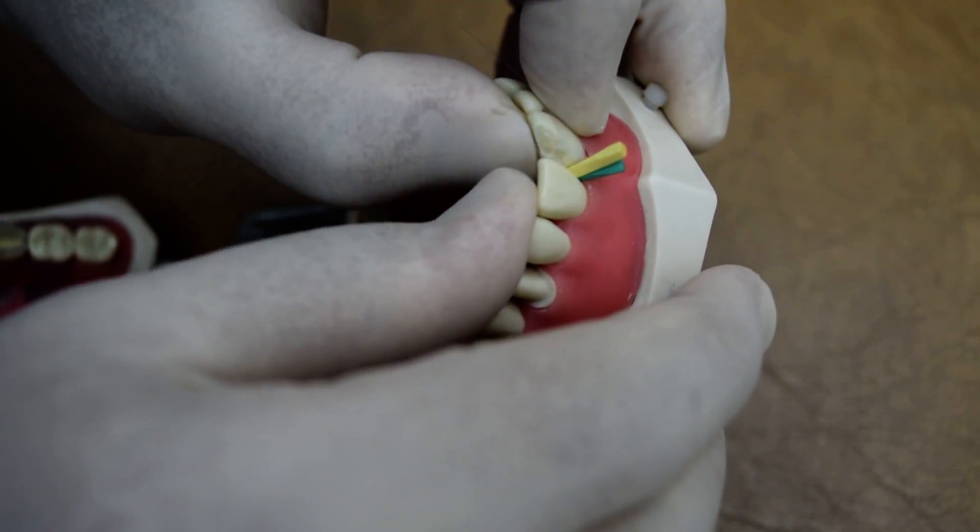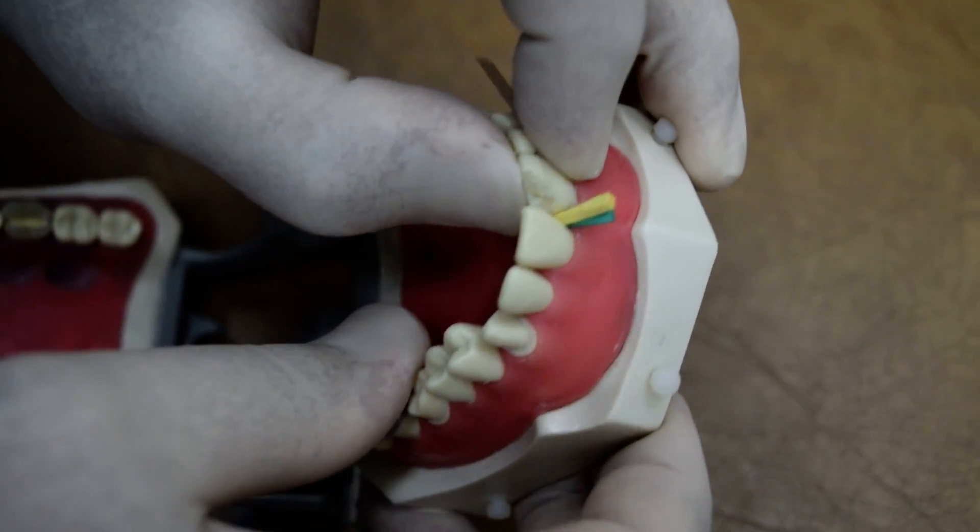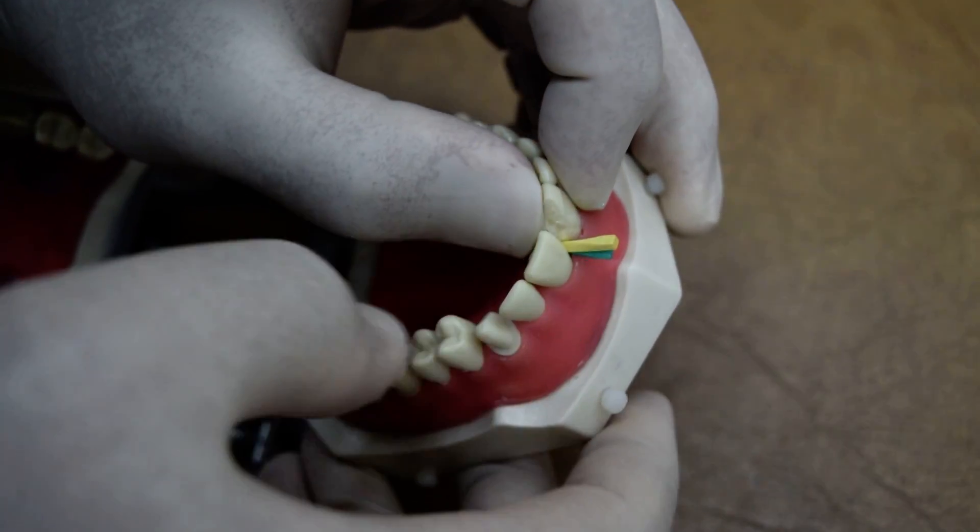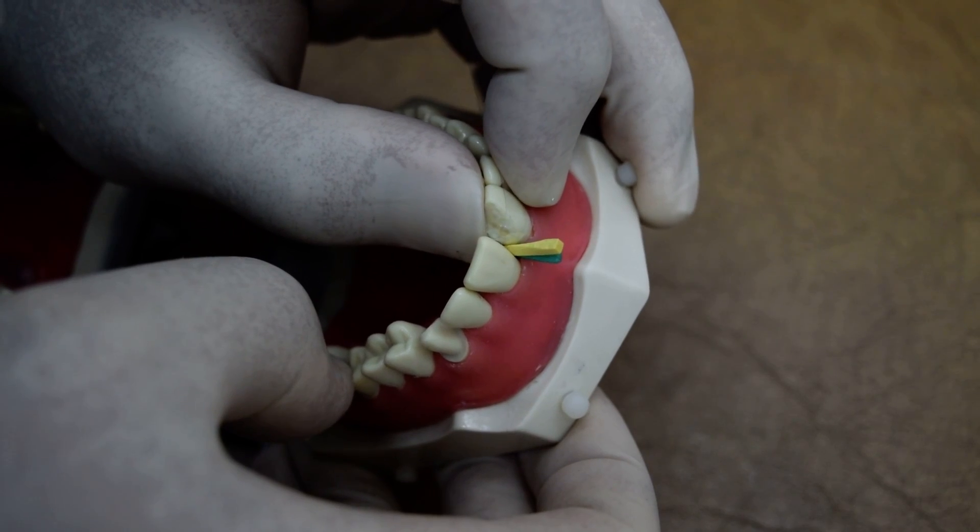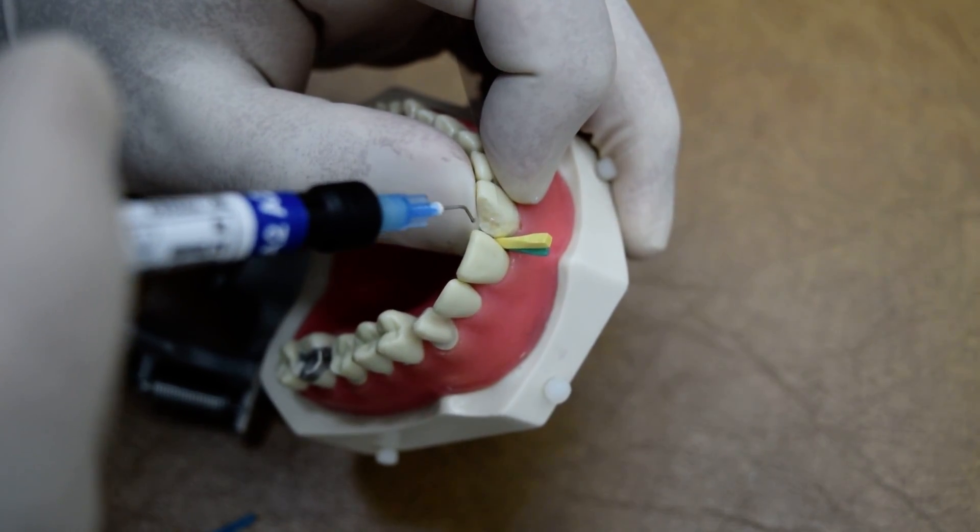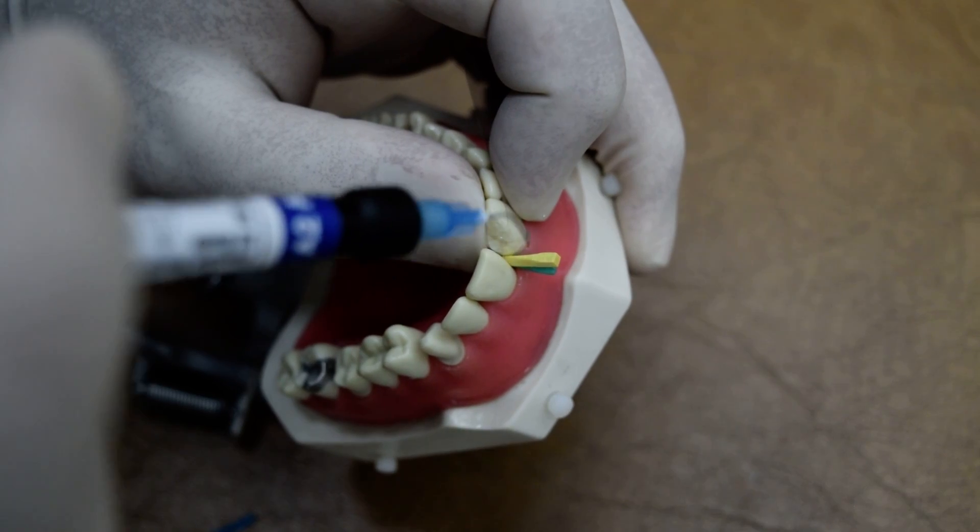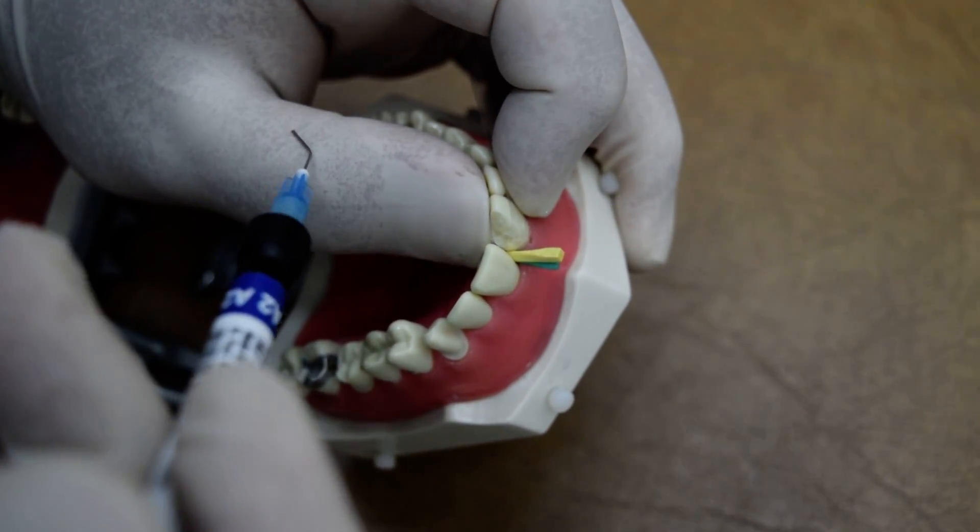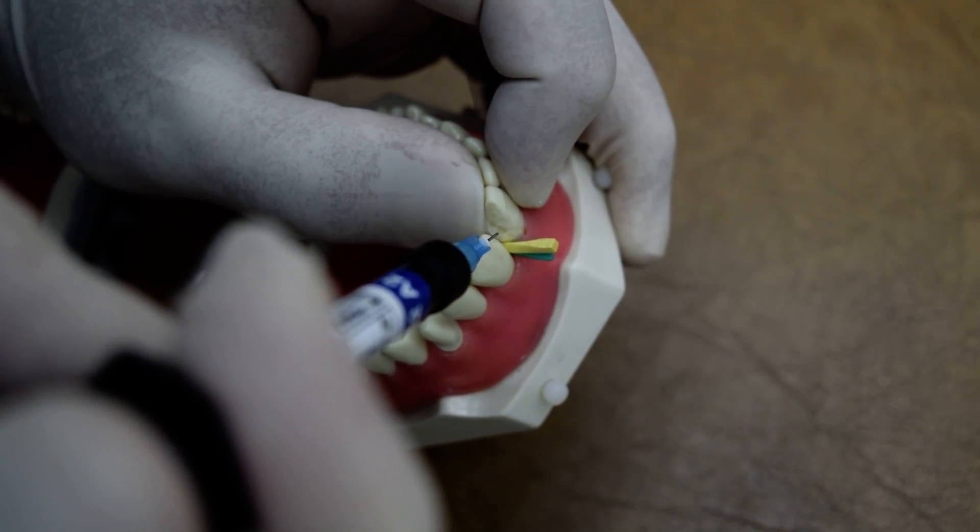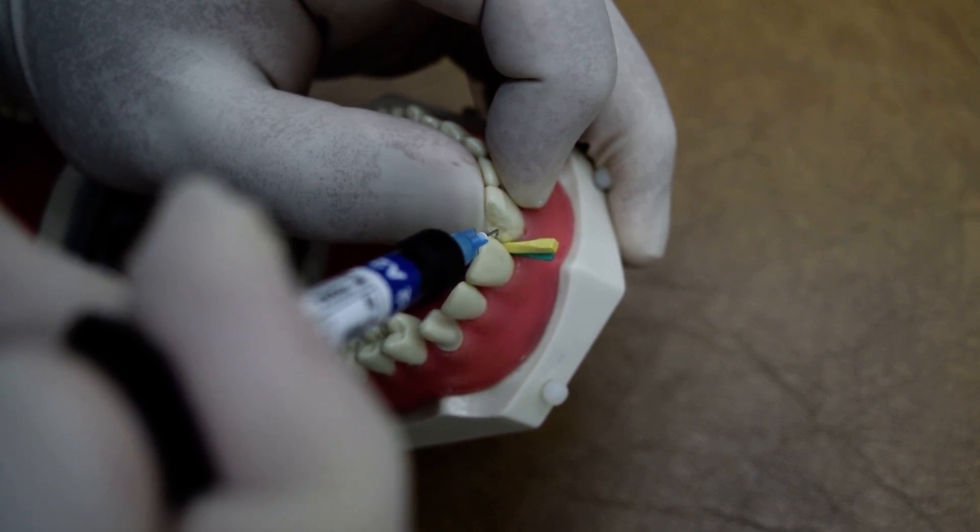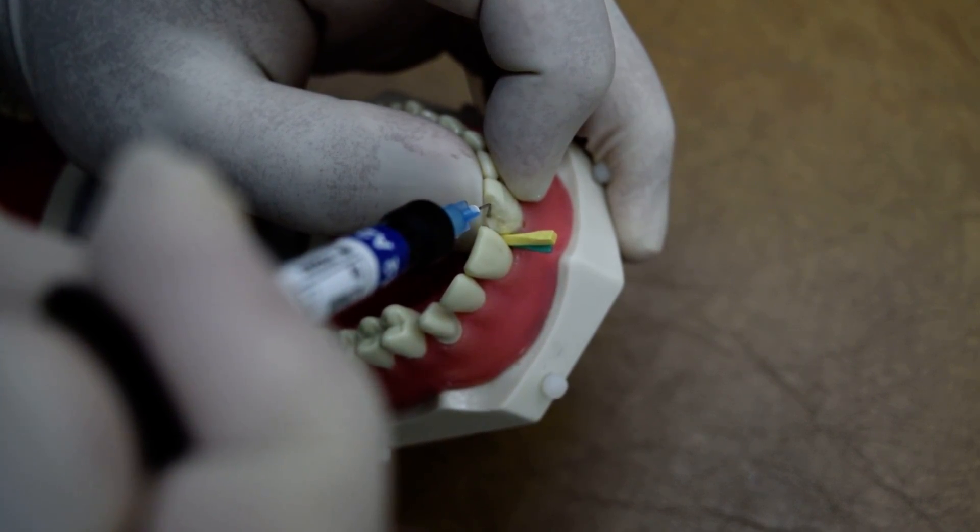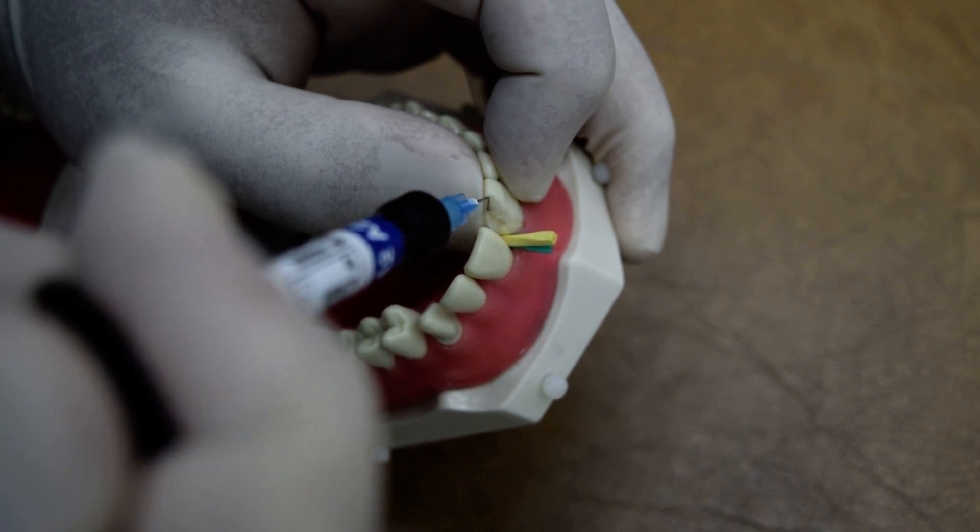Then we will start with the palatal surface first and put your finger to support the palatal surface. And then we will fill the palatal with part of the mesial. First, make sure that your tip is close to the surface to avoid any porosities, and always keep the tip of your syringe inside the material while you are dispensing it.